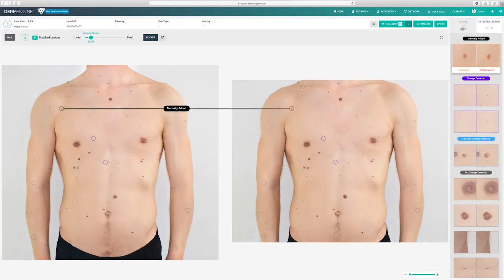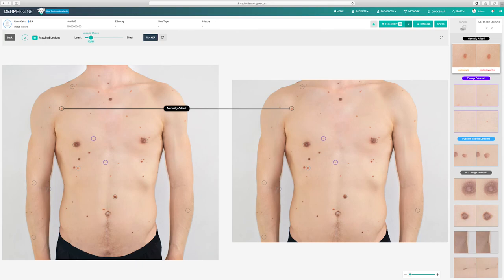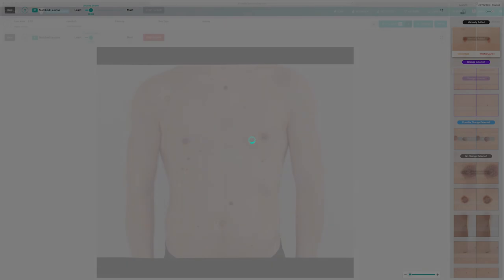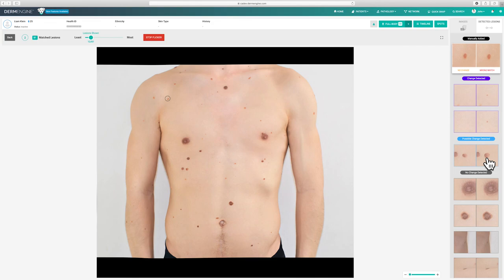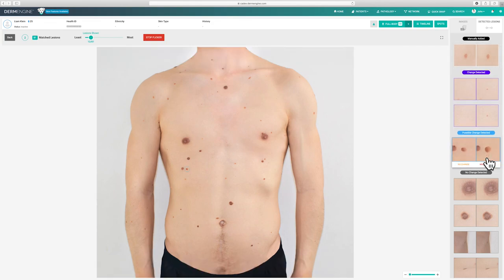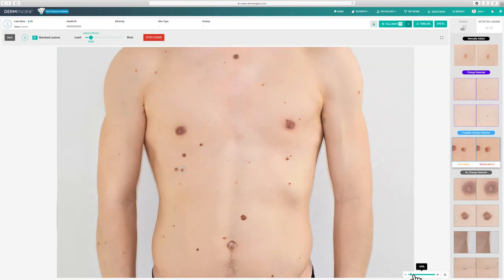In addition to parallel pan and zoom, DermEngine offers the flicker tool as an easy method for viewing and detecting changes. Once you've loaded two images into the viewing pane, simply click the flicker button. The two images will then lay over one another and flicker to help highlight any potential changes. You can zoom in on certain lesions to notice any subtle differences.